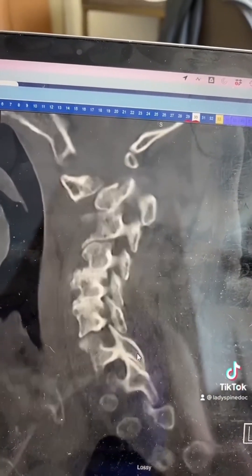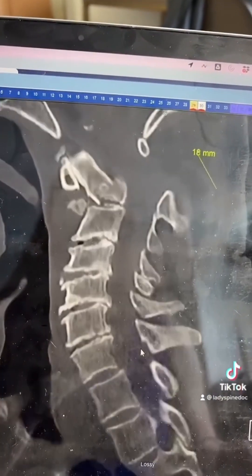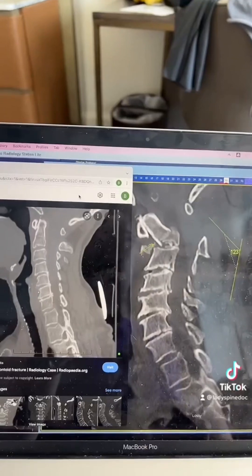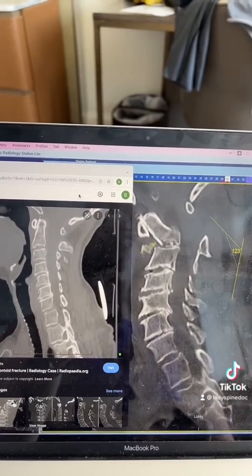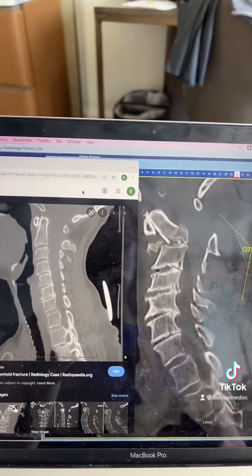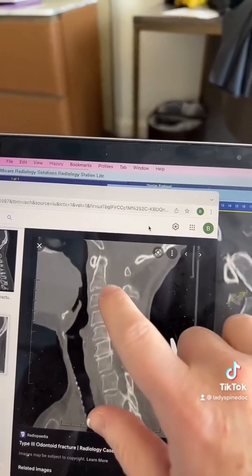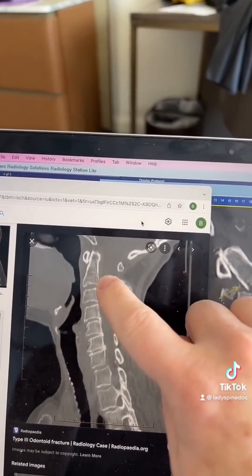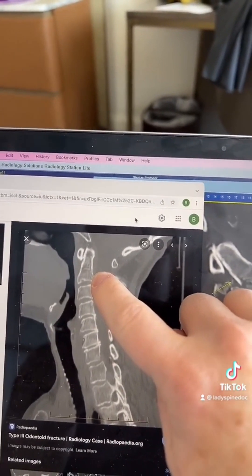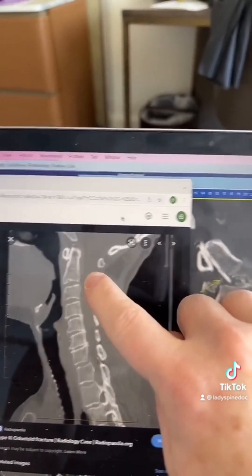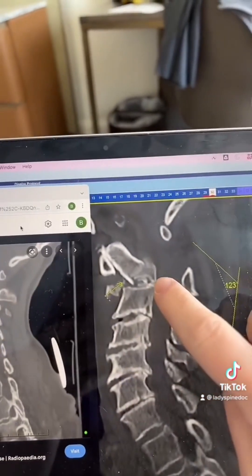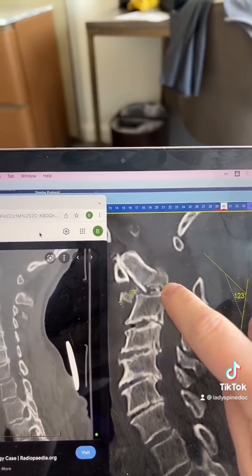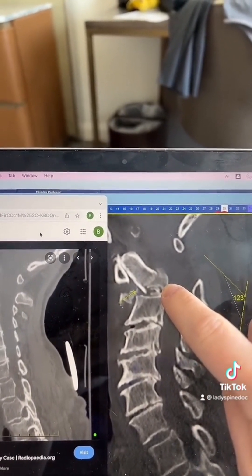This is the patient's CT scan. For comparison of normal, this is what a normal C2 bone — the odontoid bone — should look like on a CT. And this is what this person's CT of their C2 bone looks like.